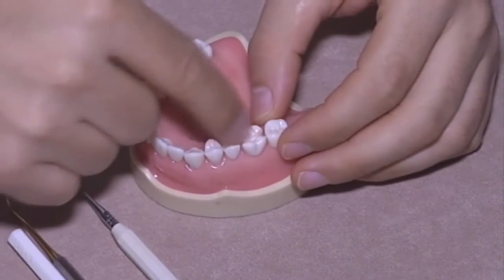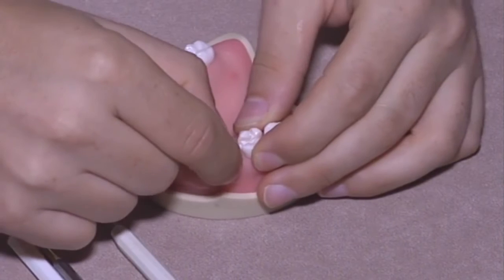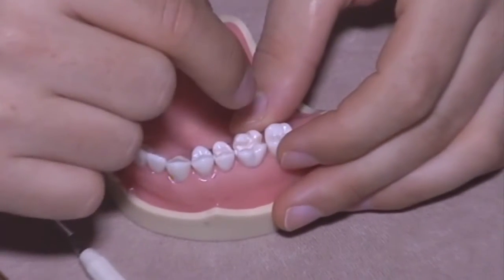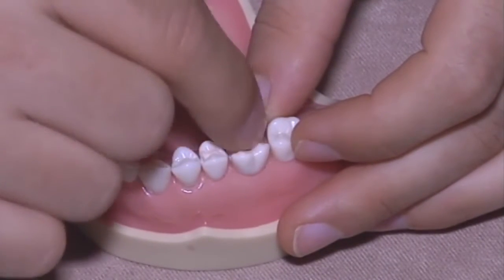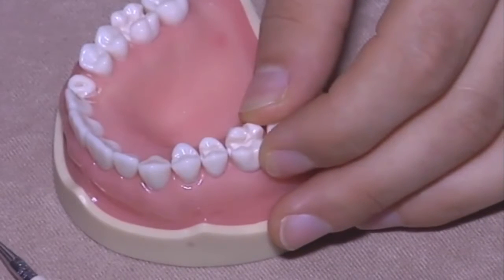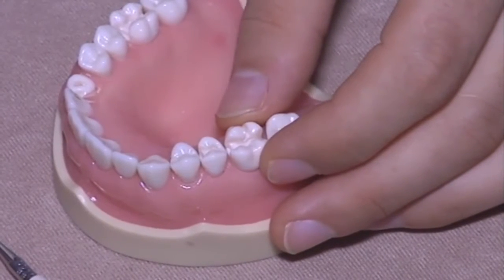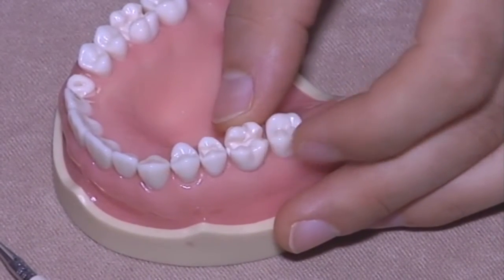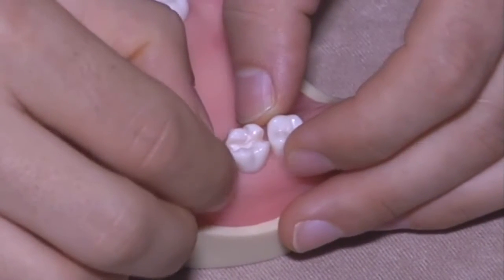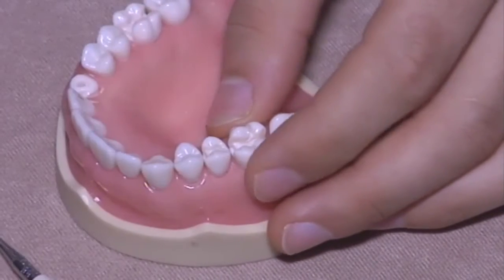Consequently, we're gonna do two restorations now. On the first molar, we're gonna layer dentin and enamel shades, in case you want to mask as much as you can the natural color of the tooth. In the second premolar, we're gonna use just one shade of composite.